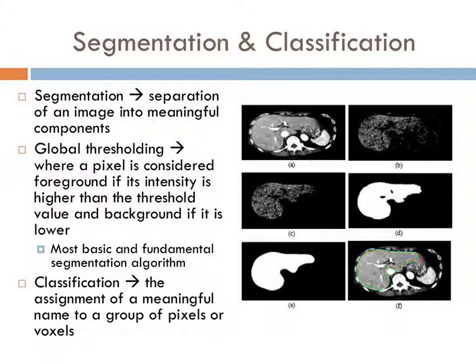Figure 8.6 in your book also gives an example, so I'd like you to take a look at that as well. If you've ever done any angiography 3D reconstruction with CT studies, you're performing thresholding when you remove bone from the images. Oftentimes the contrast materials and the calcifications will still be included in the images when thresholding is applied because they look similar to bone in the computer's eyes.